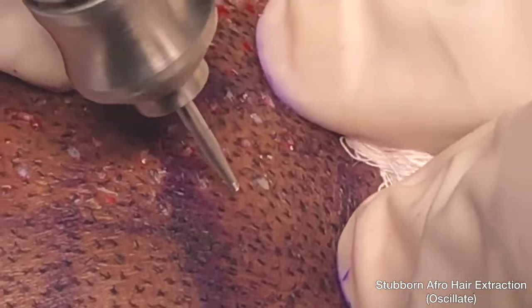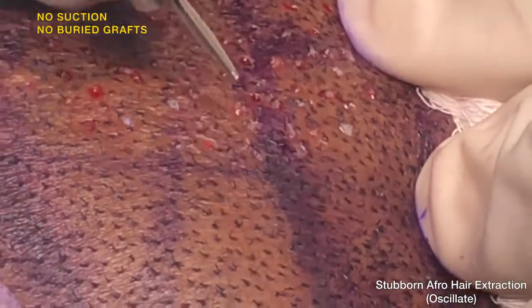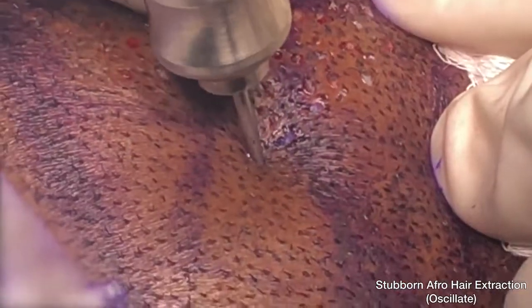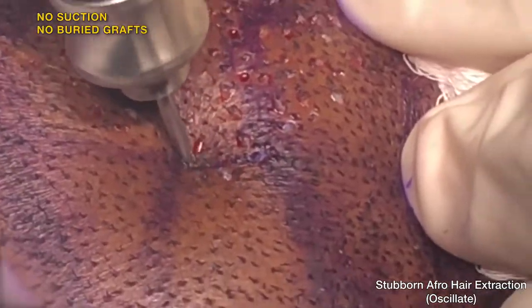For the first time, there is one unit that confidently performs every kind of case with minimum transections, with very good wound profile, very high quality grafts, and minimum effort or skills needed from the practitioner. There is less need to struggle guessing angles or positioning and placing the punch in particular ways that require extraordinary skill sets.